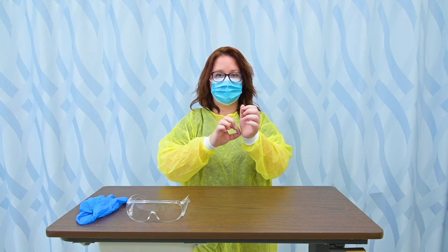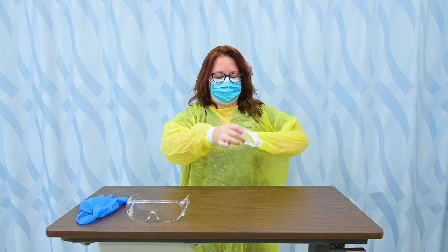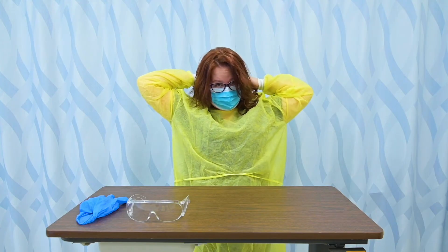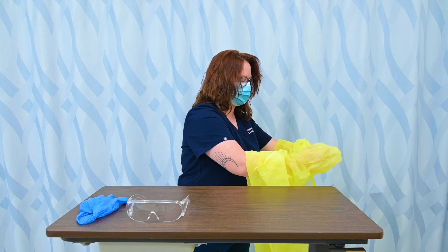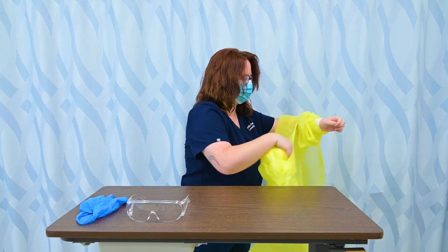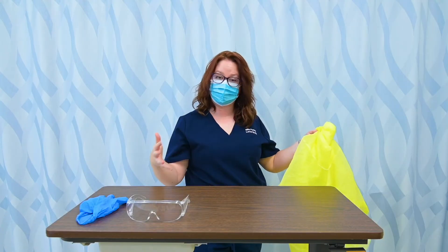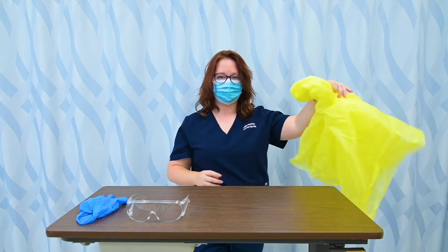I'm going to remove my gown. I'm going to pick it up by the cuff and slip it over. I need to untie it first — in real life I often just break the ties, but since I want to reuse my gown in lab, I'll untie it. Now I want to roll it down and remove my hands by touching the cuff. That farthest part of the cuff was protected by my glove cuff, so that's safe to touch. Then I touch it by the inside that was against me, and I can then dispose of that as well.